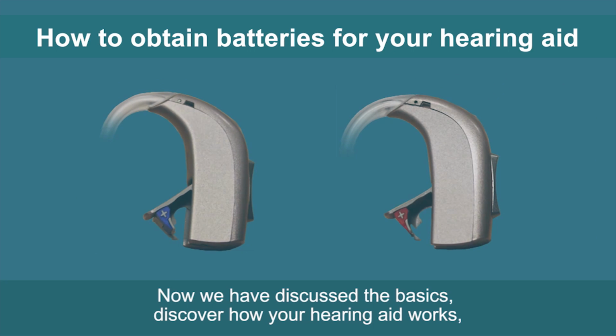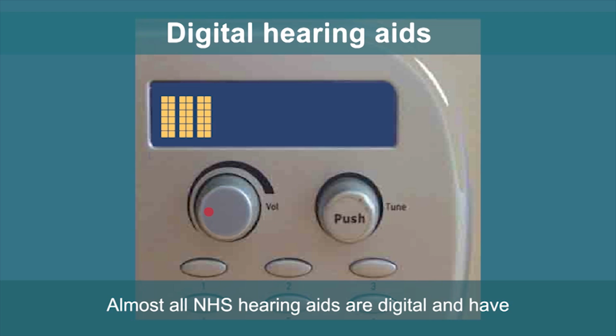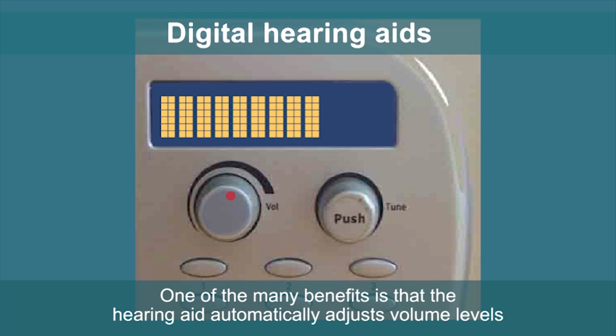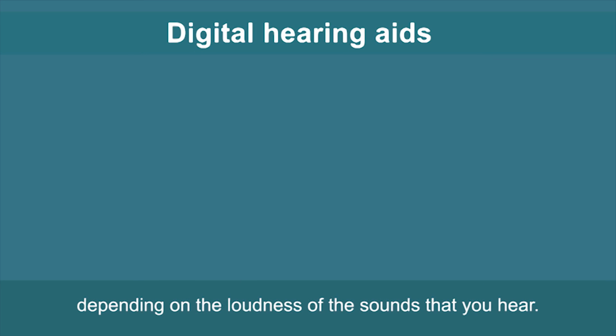Now we have discussed the basics. Discover how your hearing aid works before looking at how to use your program and volume switch. Digital hearing aids. Almost all NHS hearing aids are digital and have many features found on privately bought hearing aids. Digital hearing aids analyze sound using a computer chip. One of the many benefits is that the hearing aid automatically adjusts volume levels depending on the loudness of the sounds that you hear.